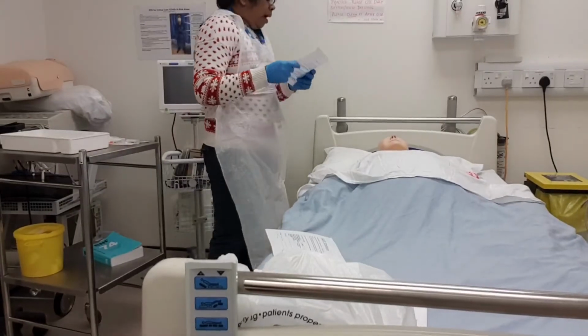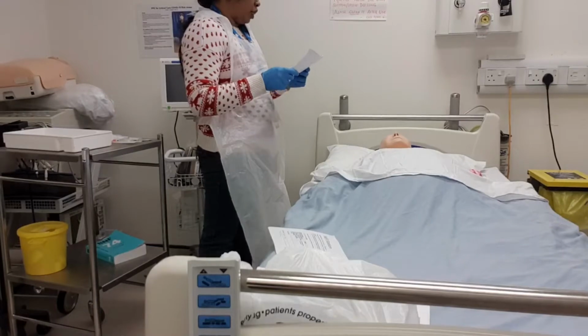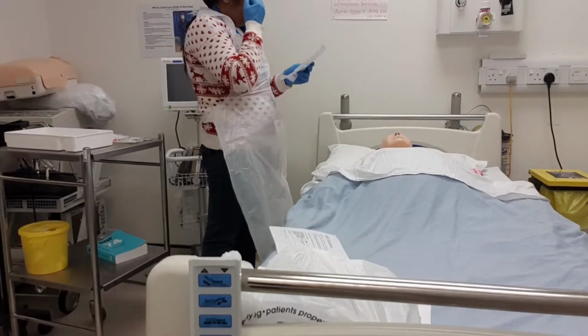Good morning. My name is Rishmi. I'm the staff nurse who's going to look after you today. I'm here to give you a subcutaneous injection. Is that okay with you? That's fine, thank you.